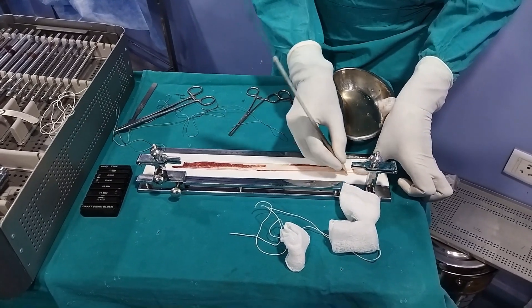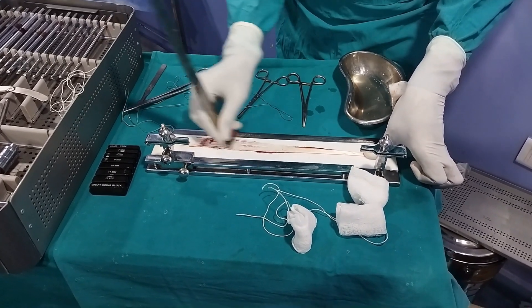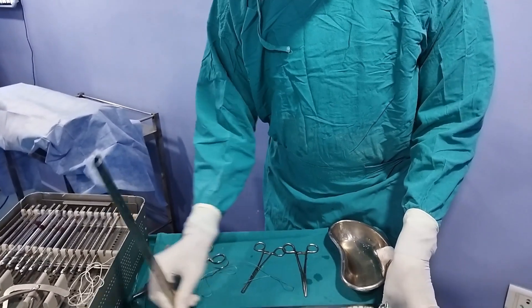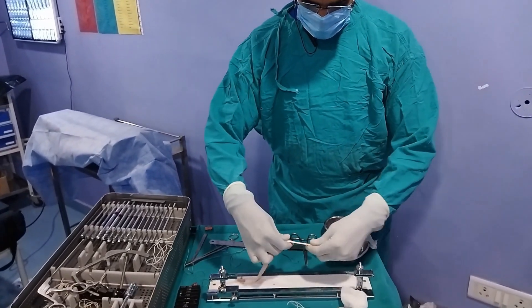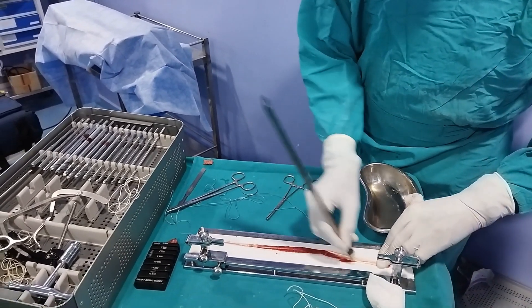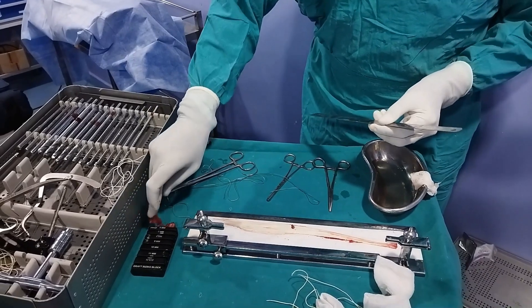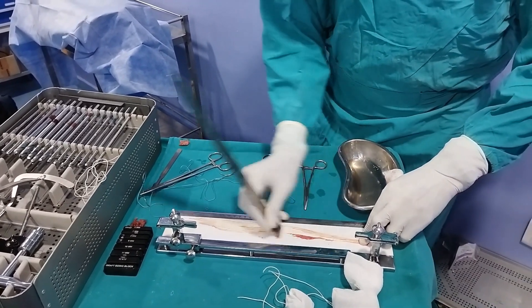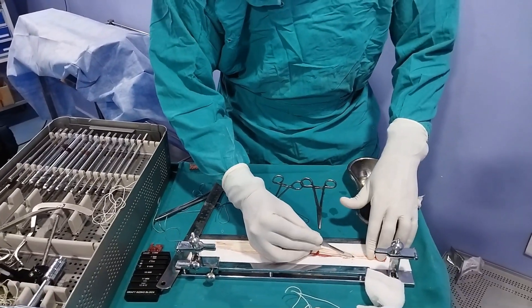The next step is to remove all the muscle tissue attached to the tendon. You need to remove the entire muscle from the peroneus longus, because if muscle remains attached to the graft it will lead to decreased bonding between the bone and the tendon. This is the most important step — use a scalpel or the back of a knife to remove all muscular tissue until you have a pure tendon.